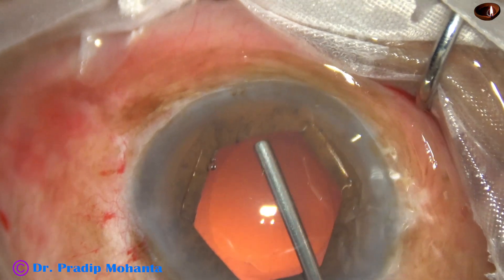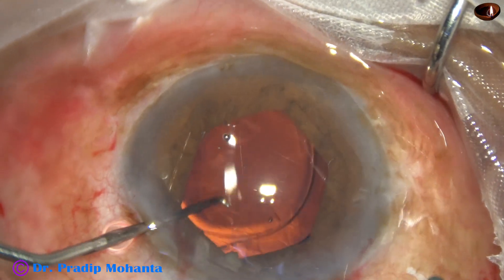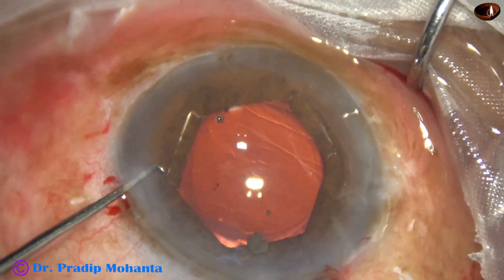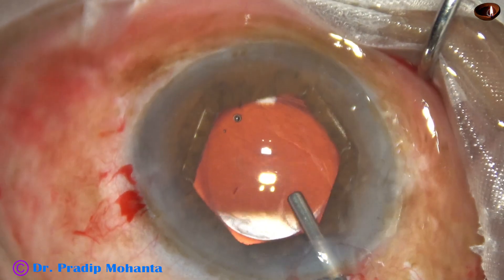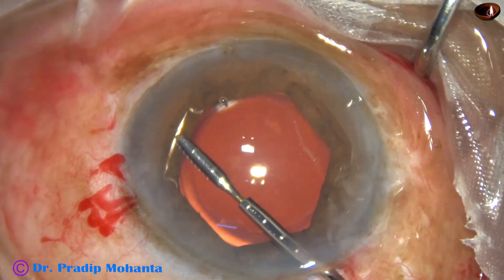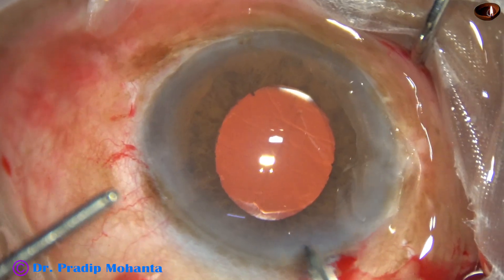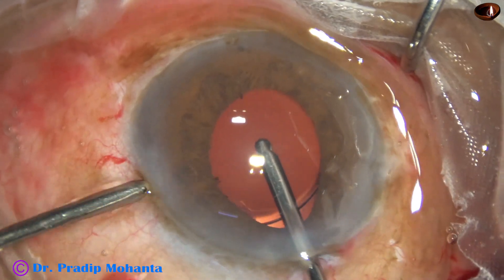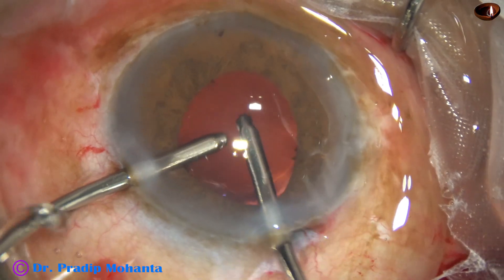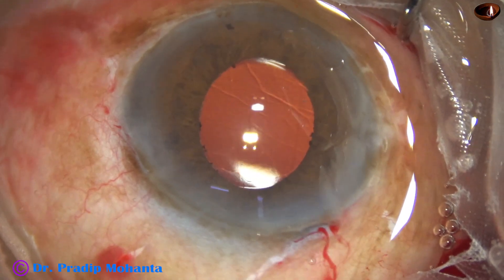I inject visco into the capsular bag and fill up the anterior chamber. A single-piece foldable intraocular lens is placed in the capsular bag. At this time, I see a small bit of nucleus near the main wound. I press the posterior lip of the wound and it comes out. With the help of the B-hex forceps, I remove the B-hex pupil expander. Cortex is nicely cleaned — I used Simcoe, which I have not shown in this video because the video is already long. The surgery took about 19 minutes and I have edited it to about 12 minutes.